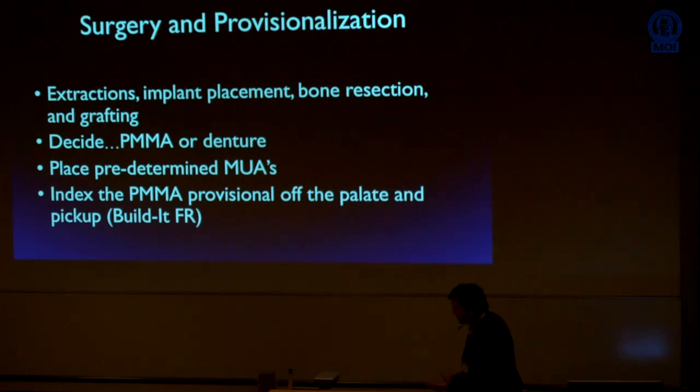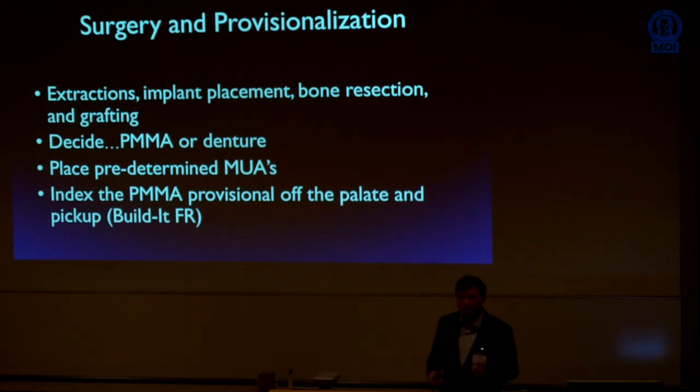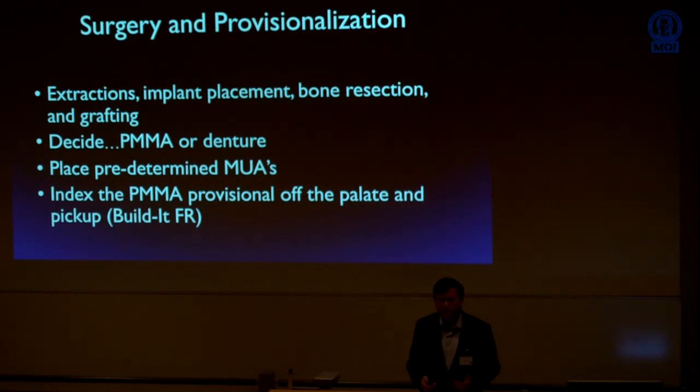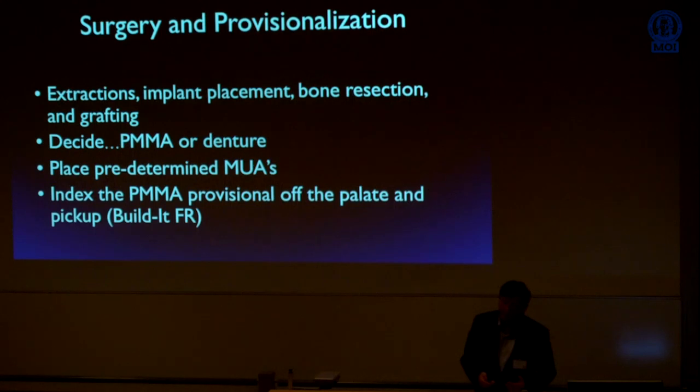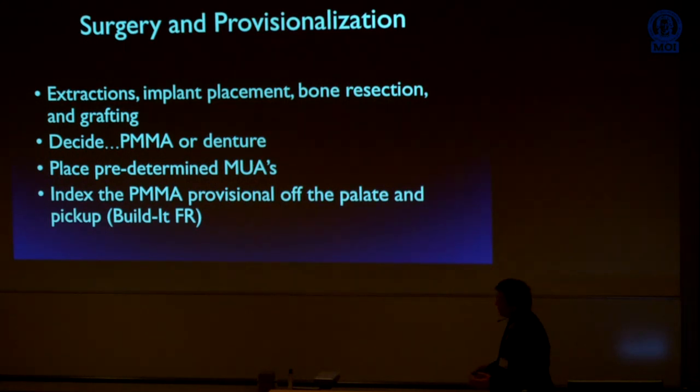So we're coming into the surgery equipped with a milled PMMA provisional. I also will have made a full arch denture, just a conventional denture. Now the flanges on that denture are very shallow because what the Trios won't do is register mobile tissue. So I know that it's very, very shallow. Out of, I think, 12 or 13 cases I've done so far in the upper arch, I've only had to use the denture twice, I think. But in both cases it worked well, with a chairside hard reline.